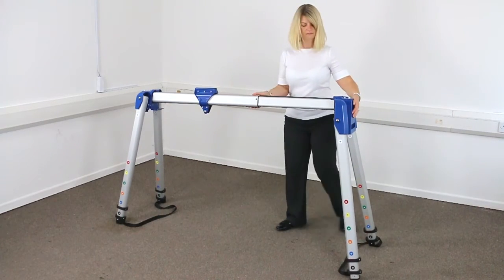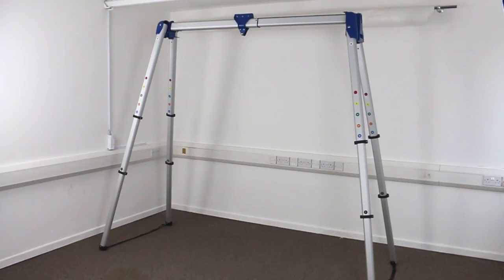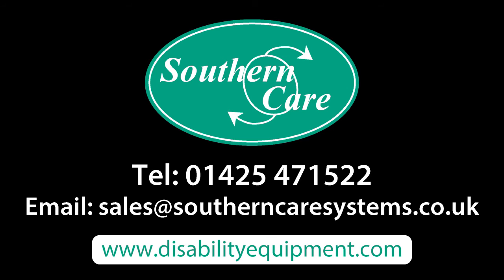Please see our assembly video for full instructions on putting up and taking down. Our portable gantry is available to buy or rent on a short or long-term basis. Please get in touch if you'd like to find out more.